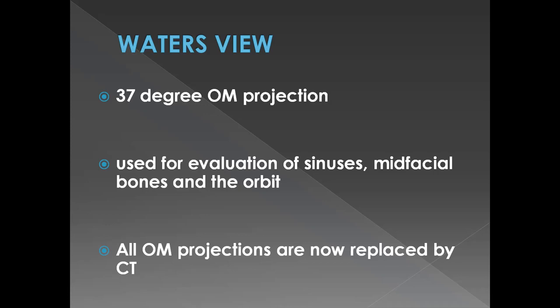One thing you should obviously know, some of you are somewhat new TMOs, junior TMOs. So you should know that all OM projections have now been replaced by CT scans. CT is considered to be the gold standard for evaluating mid-face trauma.